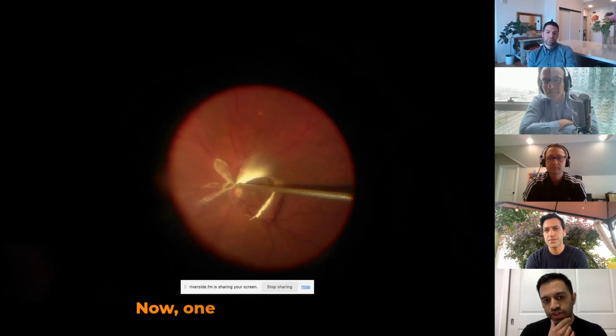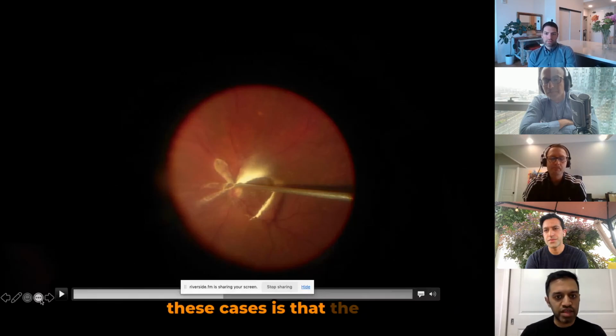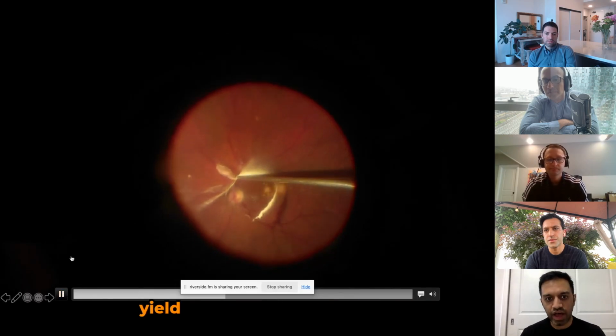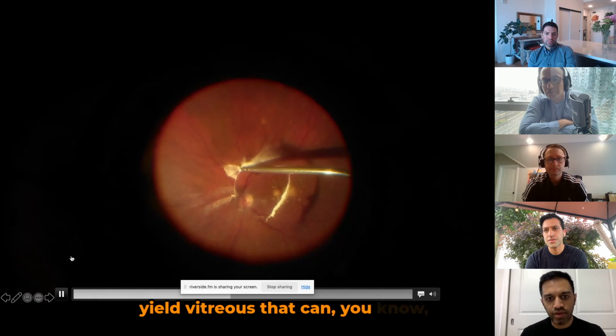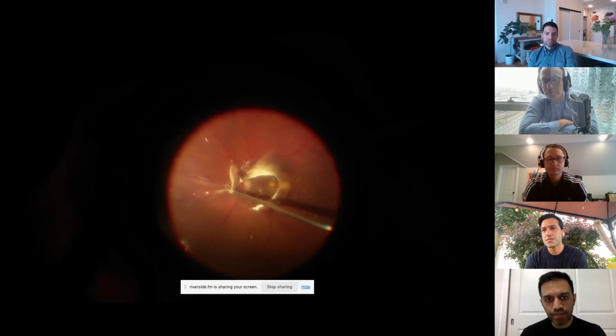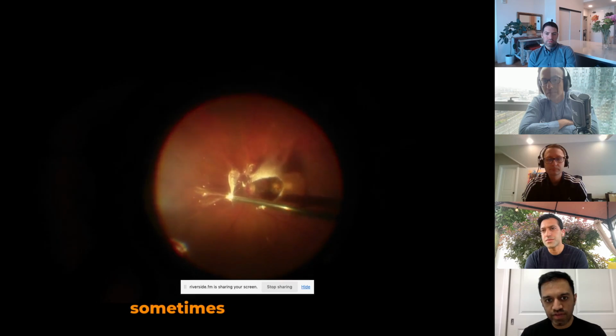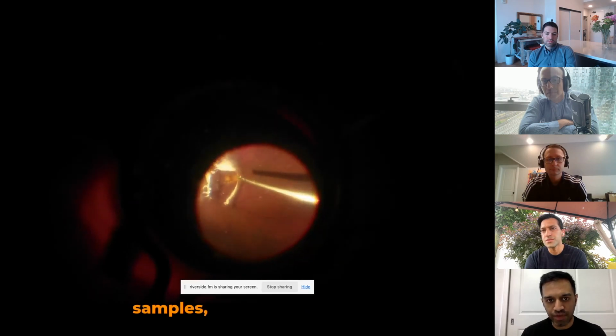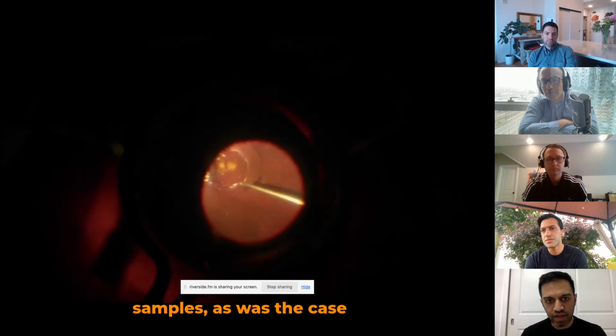Now, one thing that's interesting about these cases is that the posterior vitreous cortex that's attached to the retina tends to be sort of the highest yield vitreous that can have the lymphomatous cells in it. But I found in my experience that sometimes even when there is steroid in the eye, you can still get positive samples, as was the case in this patient.